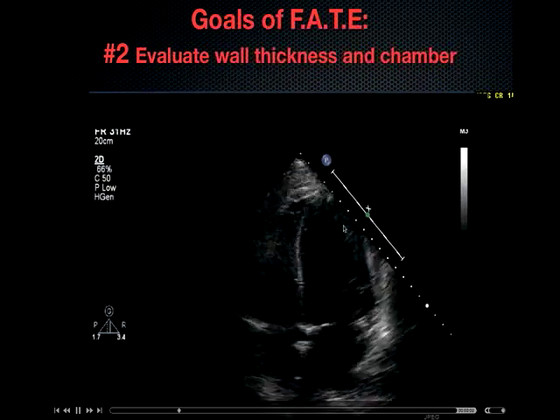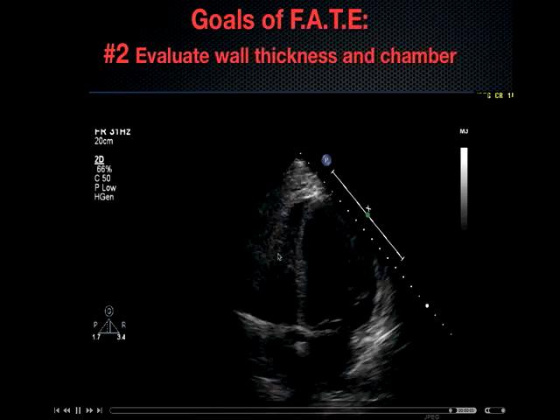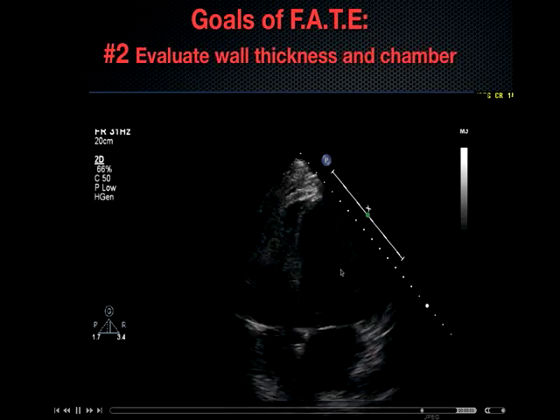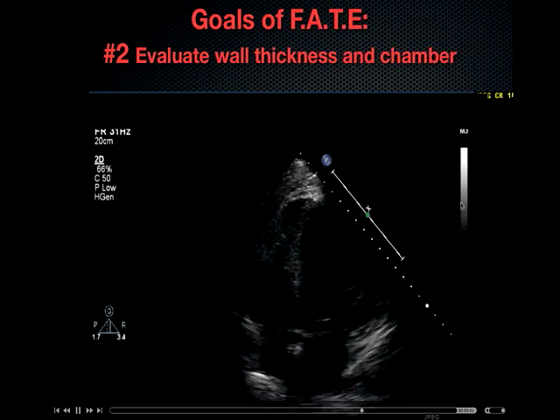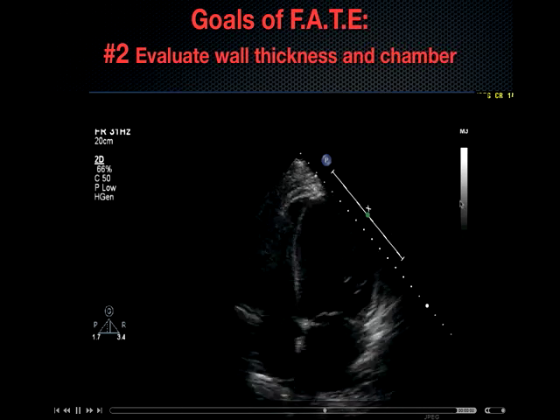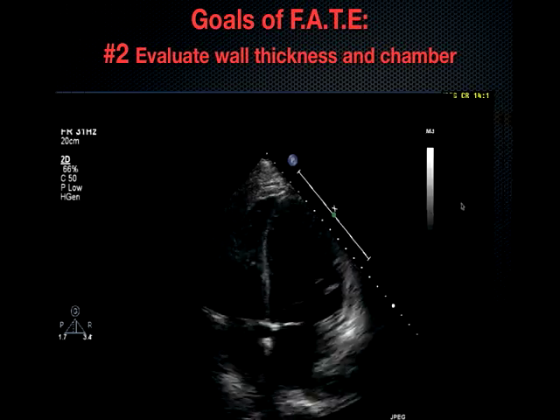Here we can see large, 4 chambers, all large. The right ventricle is almost the same size as the left ventricle. The right ventricle is actually part of the apex, which typically is mostly dominated by the left ventricle. And this would be 4-chamber dilated cardiomyopathy.